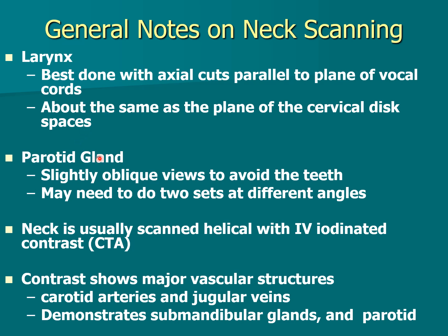I have done parotid glands quite often when I was at MD Anderson. We had to get rid of fillings in the teeth because the parotid glands are posterior to the ramus of the mandible, and fillings sometimes caused a problem, so we had to do angulation. We did not have the algorithms to clean up the streaking, and we did not have the ability to do 3D when I did those. So probably some of this information is not very current, but it's still in your book.